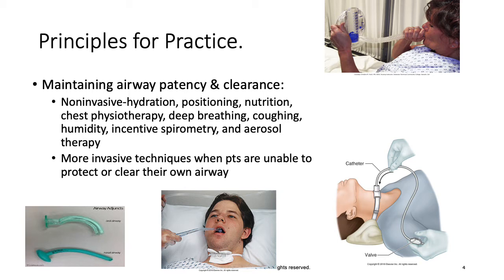And remember the function of the nose to warm and humidify. If we have a case where we're bypassing the nose, then extra humidity will be needed.